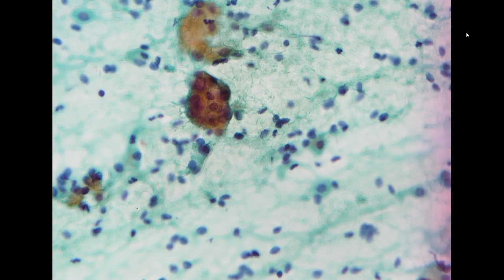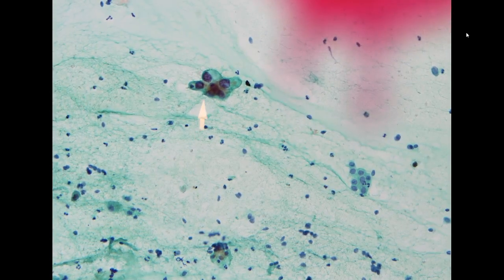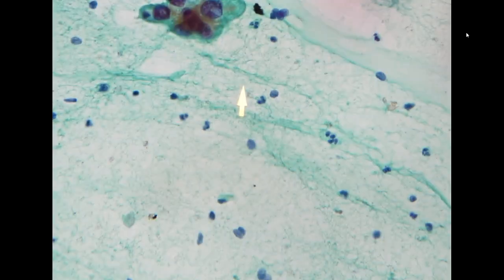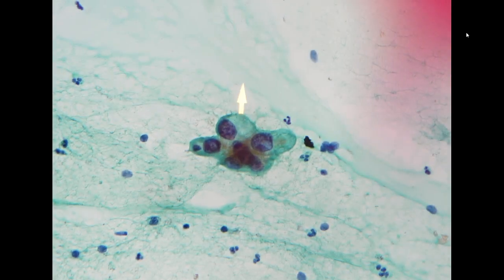Along this direction you start to see a little bit more. Again, this is a tight cluster, but it doesn't have any accompanying matrix or endometrial debris-like material. If you take a look at the cell, first of all, it is big.